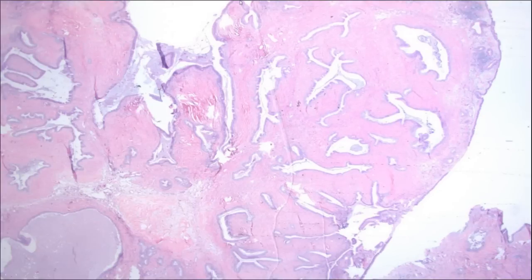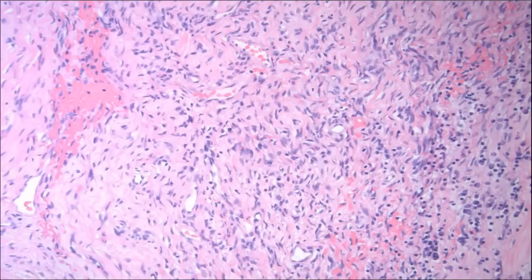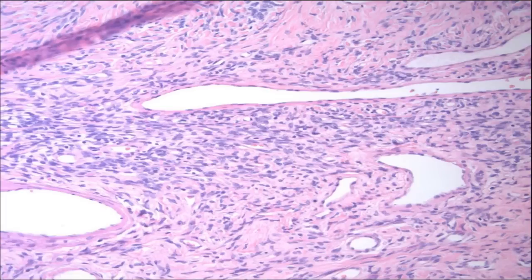And so we could see how the biopsy would be very nonspecific, because if they just got a small piece of that, you probably just thought it was some fibrosis. But as we got a little bit higher, you can actually see this keloidal fibrosis here, and some areas that had this more cellular spindle cell proliferation. And you can actually see it here.